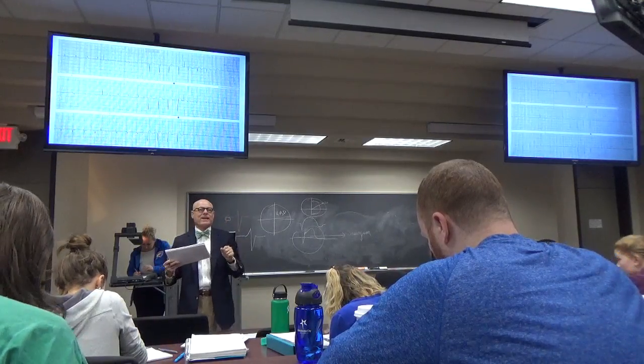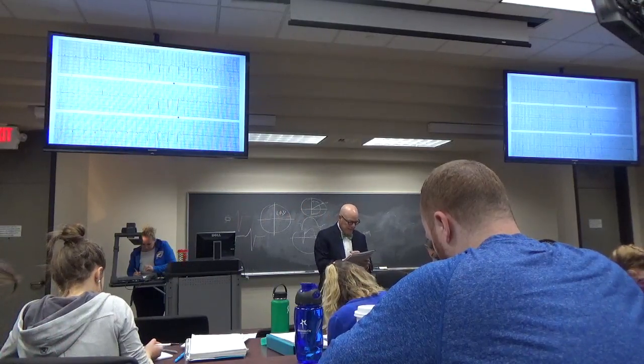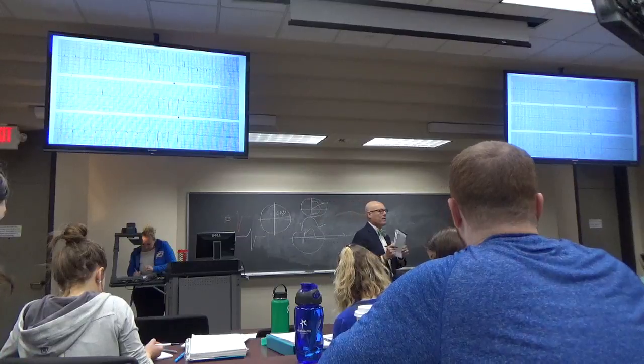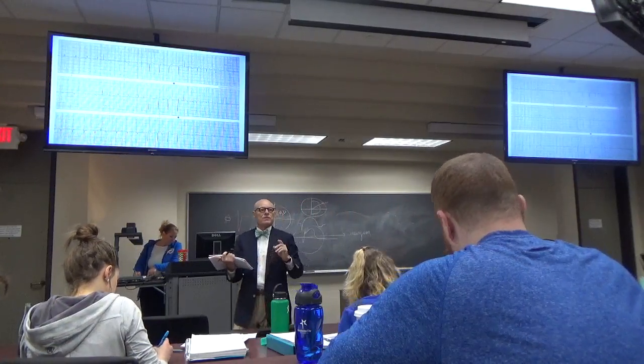Probably there's a tiny little R wave. So this probably is not an inferior infarction. No. It would be borderline. I would give you something like this on the name. Any other questions on this one?